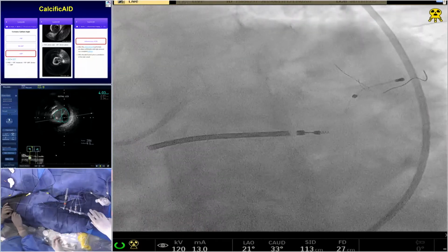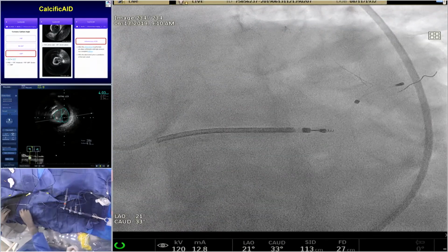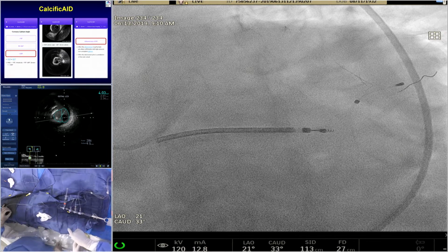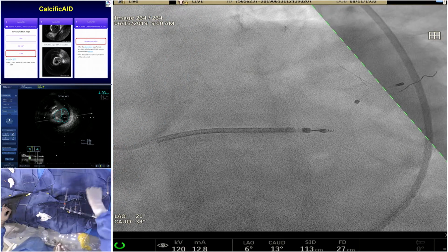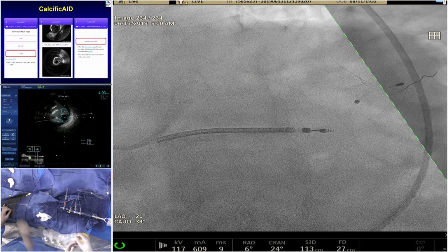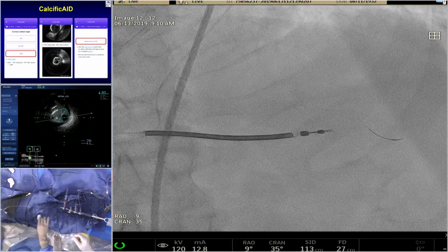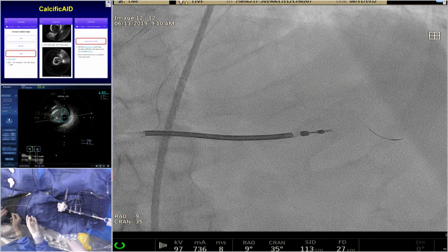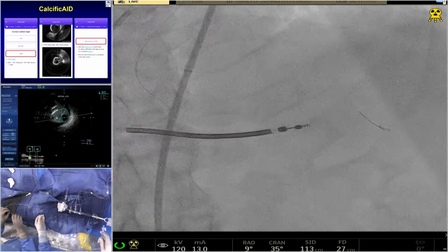So what was the decision of the panel with regards to circ? I know Dr. Colombo said to take care of the LAD, and Dr. Yves Louvard wants provisional stenting. Obviously, you have to take care of the LAD lesion first. Then for the left main, Dr. Louvard believes that given the angiographic appearance of the circumflex, which looks really hazy and not so good, and it's a large vessel, he would like to see you provisionally stent into the circ first and then see what to do.